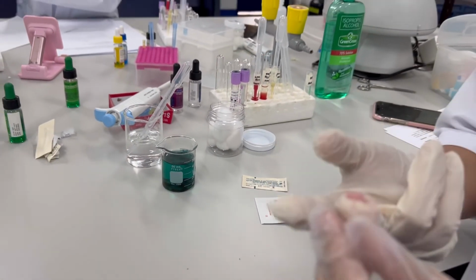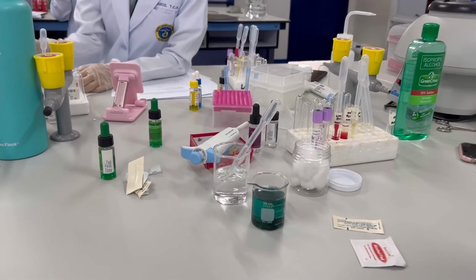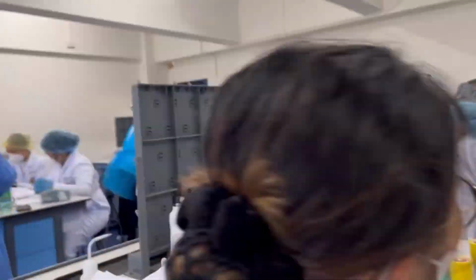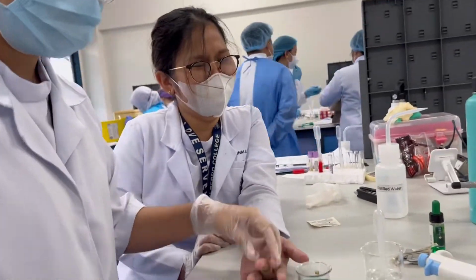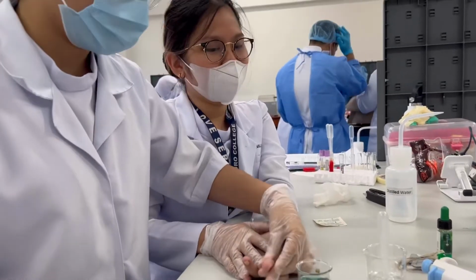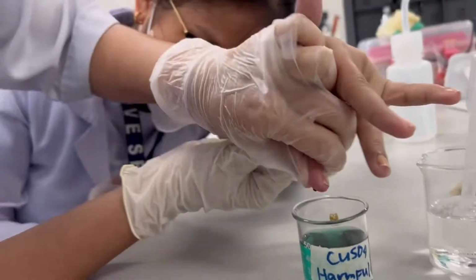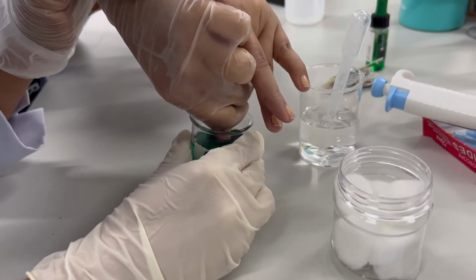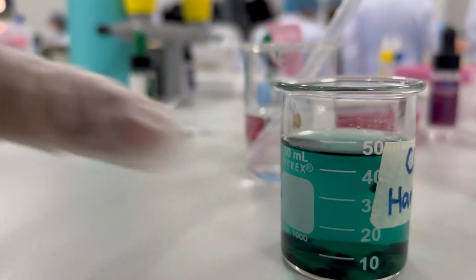Prepare the materials needed. Then prick the patient's finger. Then allow a droplet of blood to fall into the copper sulfate solution. Observe if the blood sinks or floats.